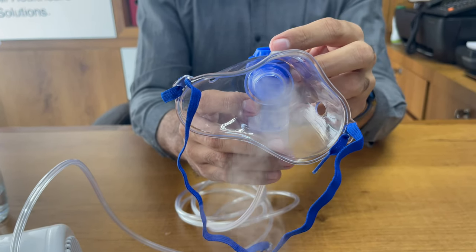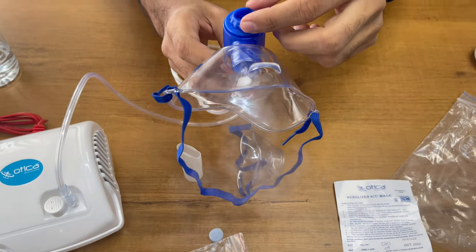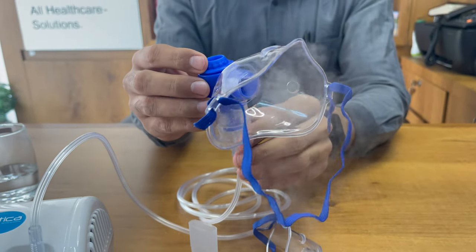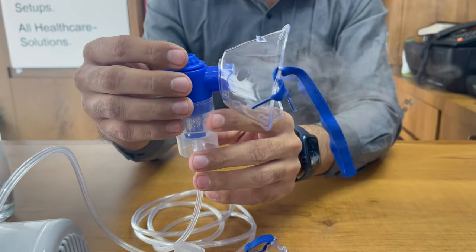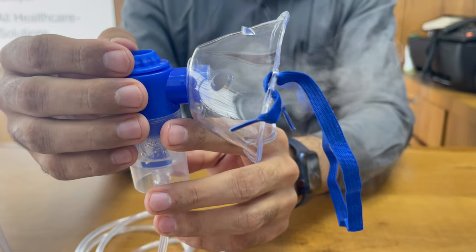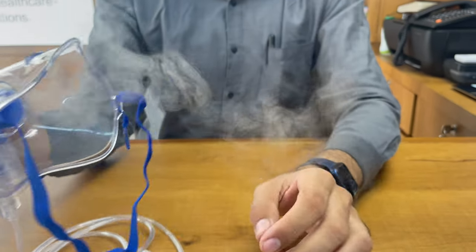You can control the flow from this dial — this is the minimal flow and this is the maximal flow. You just need to rotate the rotator according to your requirement. If it is for a baby, you can keep it on the slow side, and if it is for an adult, you can keep it on the higher side.